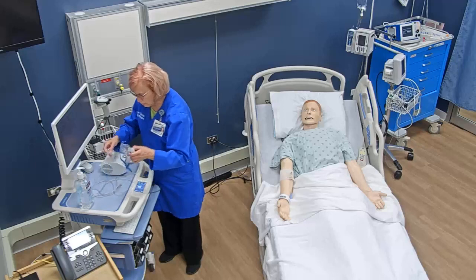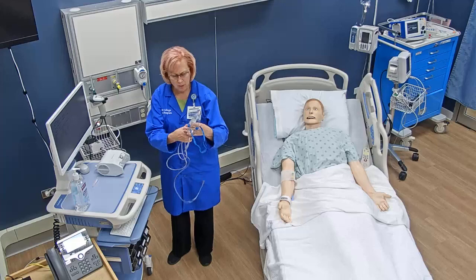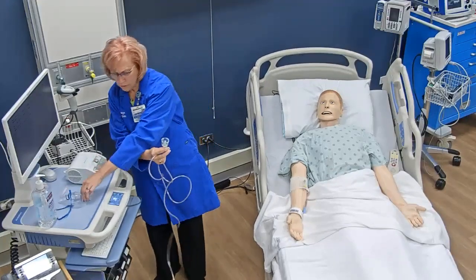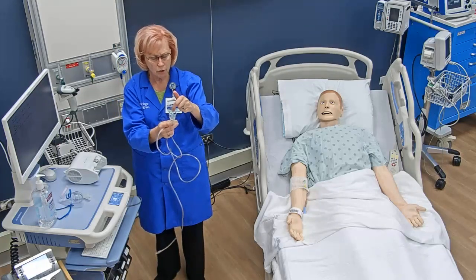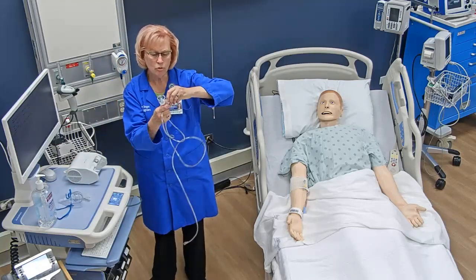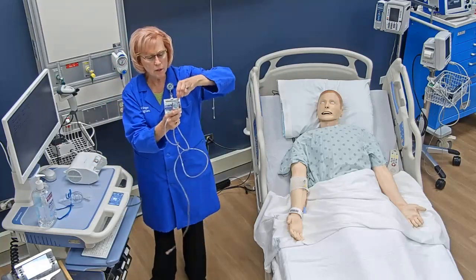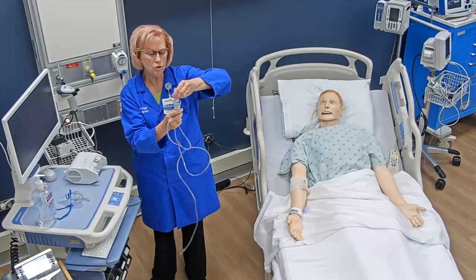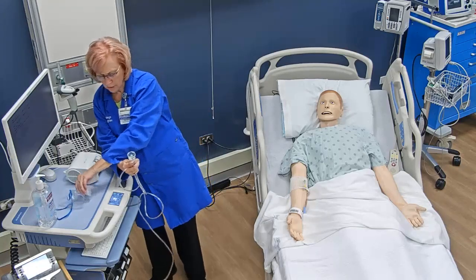So I start administration by getting the nebulizer mask, and I have to take the top part off of the bottom part. So I'm left here with this little cup and with a little center spot right here where the oxygen or the air flows. This is a little plastic vial. I open this by twisting the top and squirting the fluid into the cup until it's all in there. Make sure you get all the medicine in. Make sure you hold it upright so it doesn't spill.